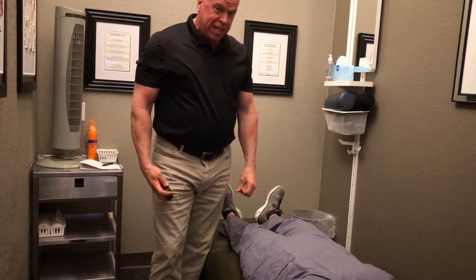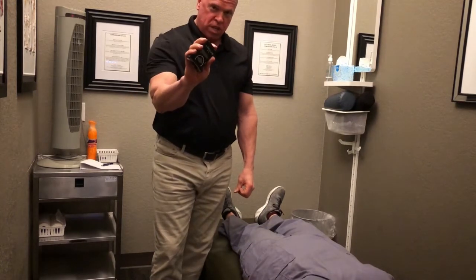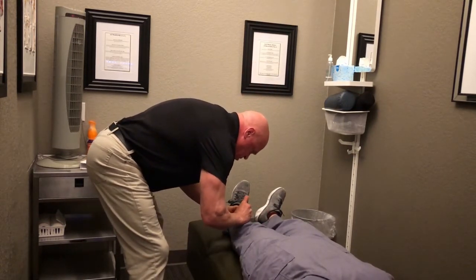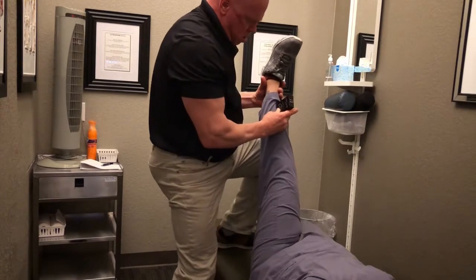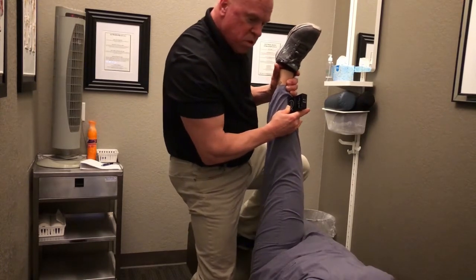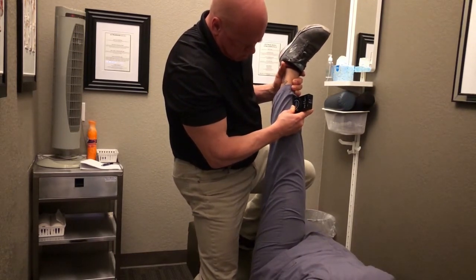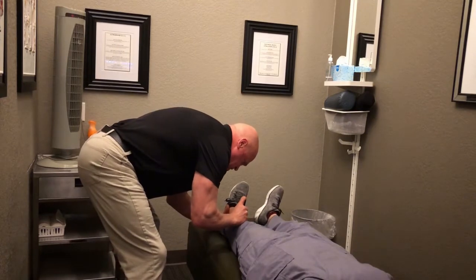To perform the validity test, you first begin by measuring the straight leg raising angle with your single inclinometer. To do so, you put the inclinometer on the crest of the tibia, zero out your instrument, and raise the leg to the maximum of hamstring tension. About there? Is that about your limit? Yes. Right. And measure 3 times, recording your angle each time. And this is an angle measurement of 77 degrees. Make sure to clear the instrument each time.